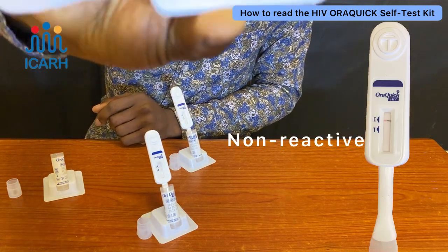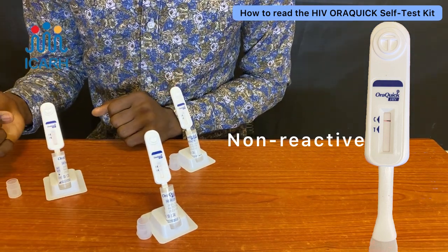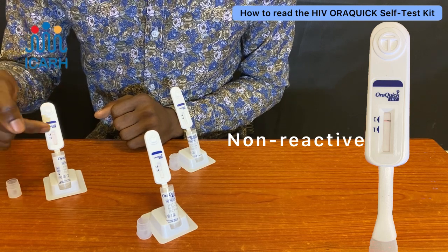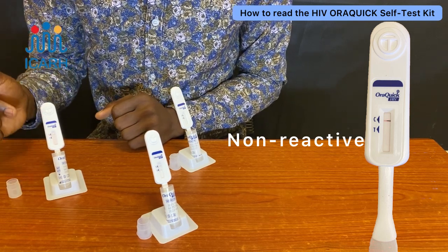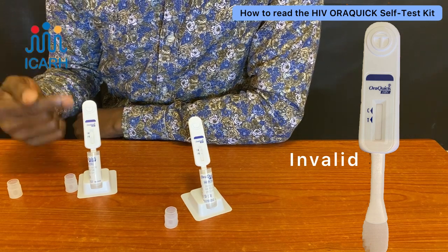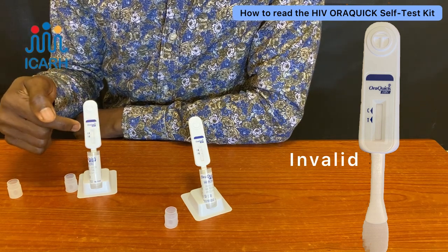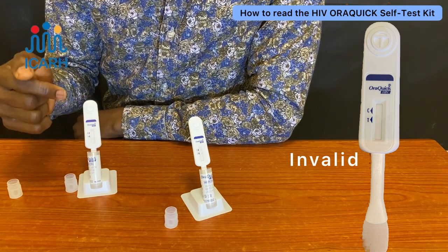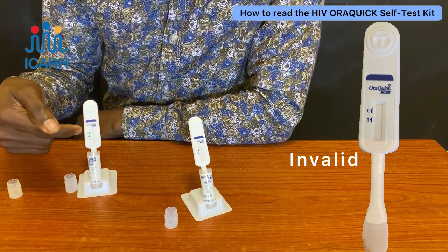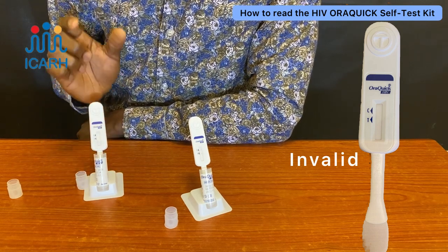For non-reactive results, you can see there is a line on the control side, showing the test kit is working, but no line on the test side — that means non-reactive or negative. For an invalid result, there is no line on the control side — or there may be a line on the test side but not on the control side. A line on the control side is required to confirm the kit is working. If neither line appears, the kit may be expired or the test was not conducted properly, and you'll need to get another kit.